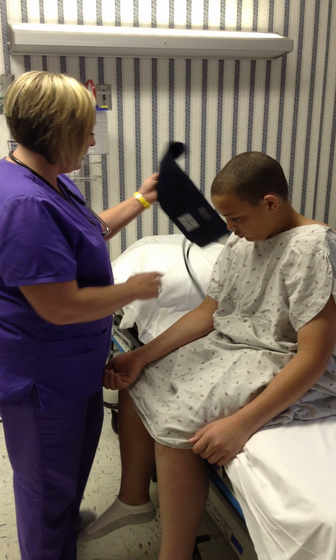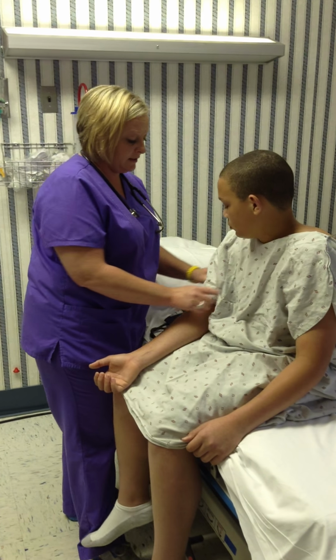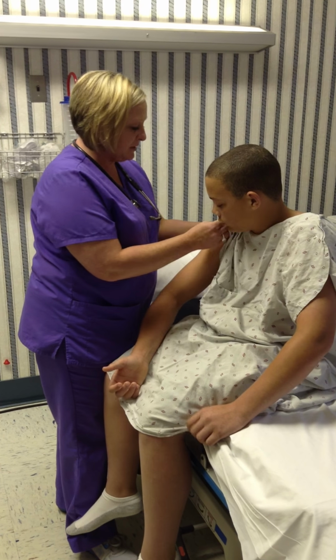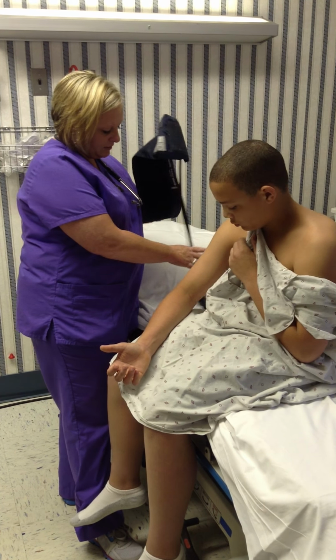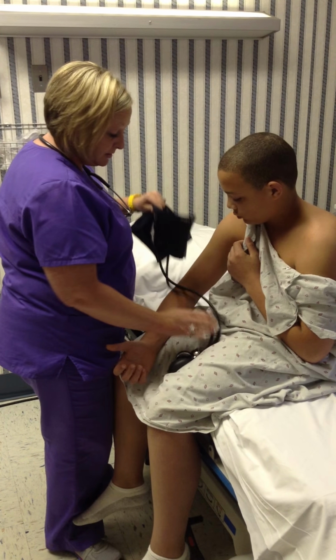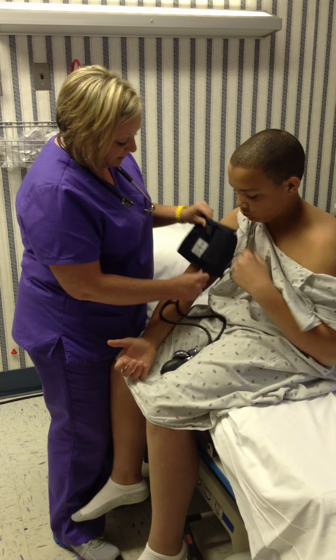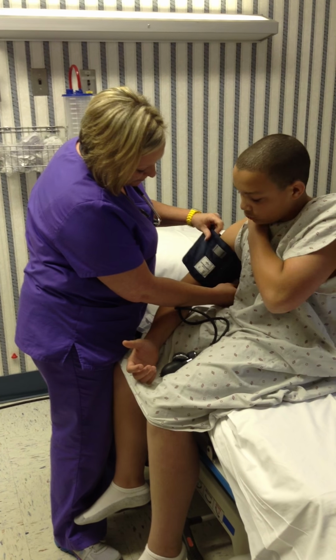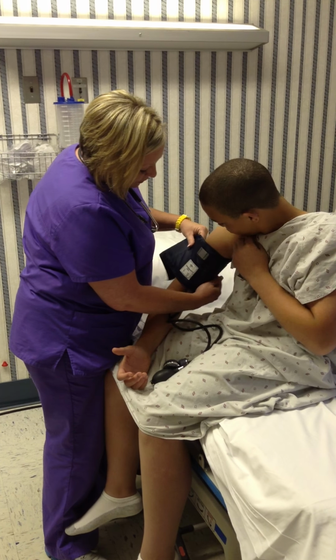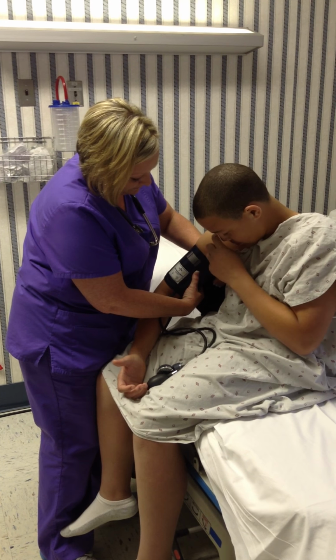Okay. So, Micah, what I'm going to do next is check your blood pressure. I'm just going to raise this up. The correct size blood pressure cuff is one that covers 2/3 of the upper arm, and you want to place it at least an inch or so above the brachial artery. So we're going to do this.